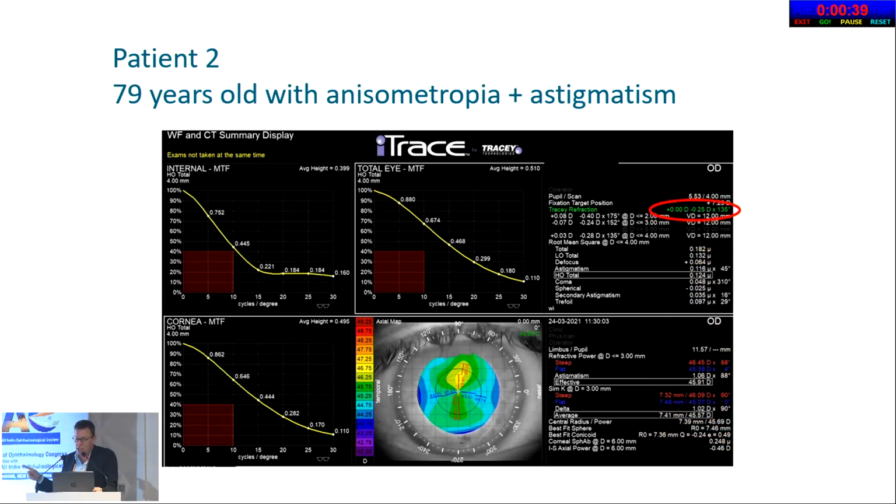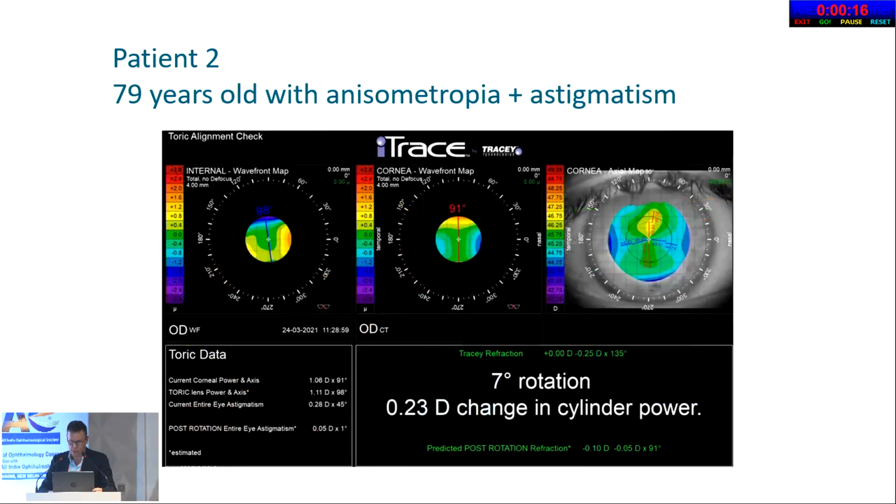As you can see, the post-op refraction, because when you're dealing with those trifocal IOLs, you want to be within half a diopter of spherical equivalent and half a diopter of sphere and less than half a diopter of cylinder. This trace refraction gave me plano -1/4 at 135 degrees with a low amount of higher order total aberrations of 0.12.